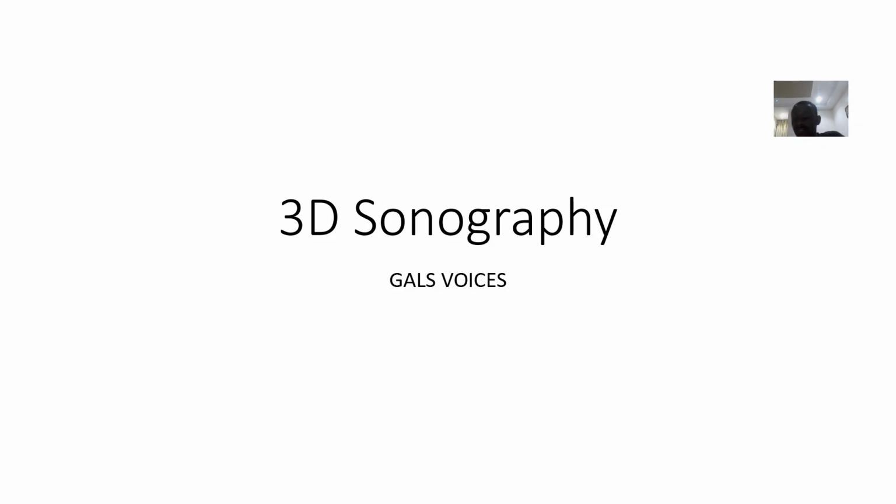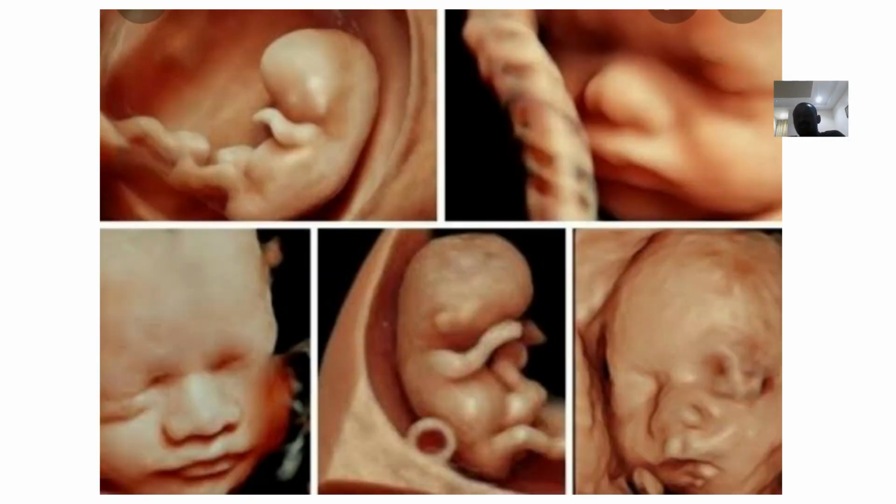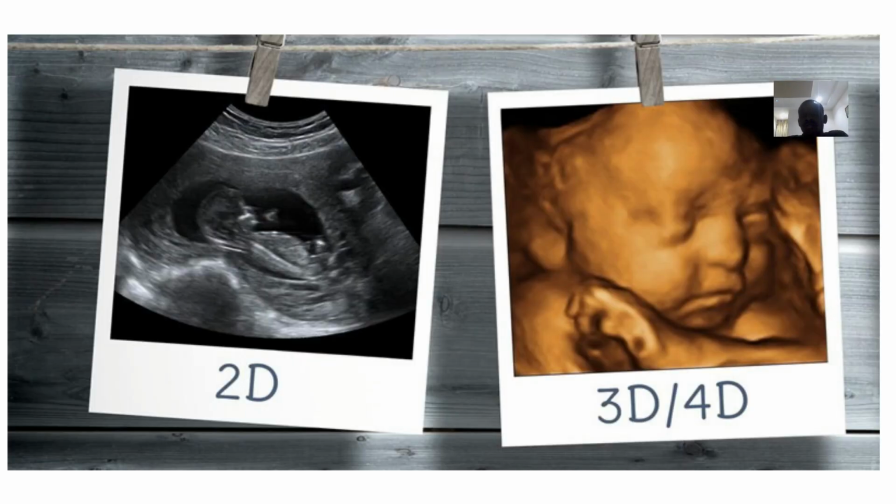So moving to the next type of imaging modality, we'll talk about what is known as 3D sonography. For 3D sonography, you are visualizing something in 3D, and it's mostly used for babies. The baby is in the mommy's tummy, so I want to monitor the baby to see if there's any abnormalities at all. So I'm actually trying to visualize the baby.